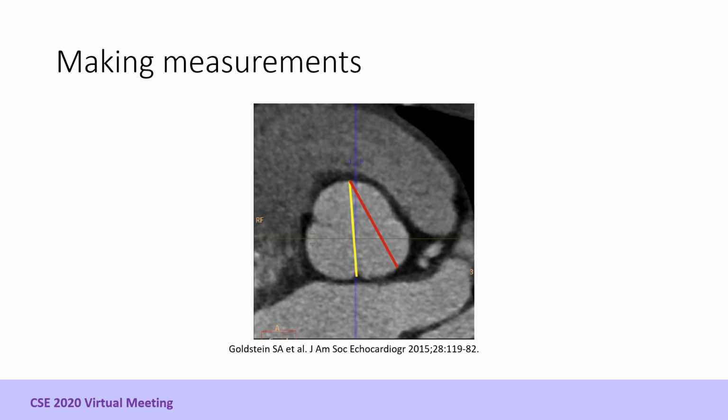Despite differences in image acquisition methods and resolution, echo, CT, and MRI are all near equivalent as standards for assessing aortic root size, although much of the normative data and prognostic significance of aortic dilation is derived from echo. It is important to understand what we're measuring, though.